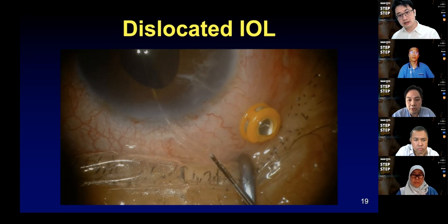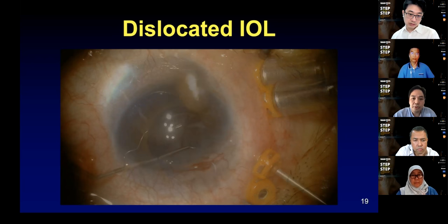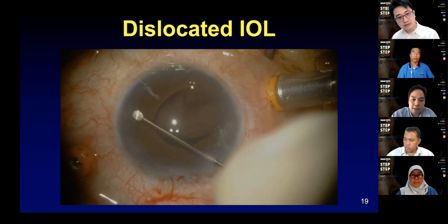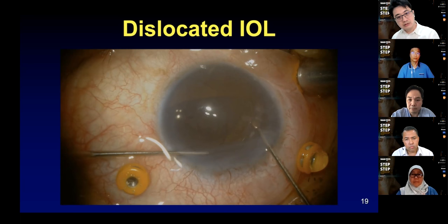So what I've done is exteriorize the haptic and remove that remnant 9-0 or 10-0 proline that was in the eyelet. The eyelet was still in good position. What I then try to do is bring forward the whole optic into the anterior chamber. I use a second instrument to lift the optic up and use my cutter to do the same, so I can bring the whole IOL into the anterior chamber. What you see here is me internalizing the haptic that I've just taken out, so that I can get hold of the other one and bring that one out, so I can clear that eyelet and start putting my proline suture through it.